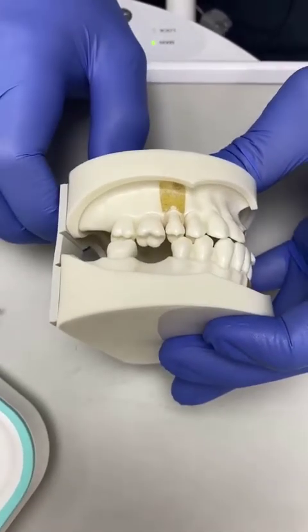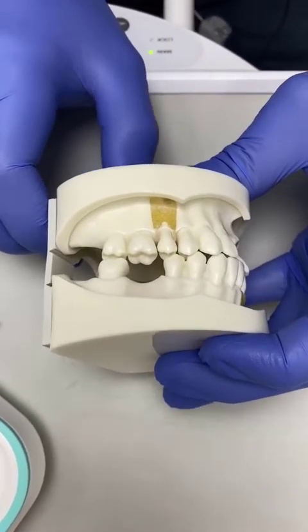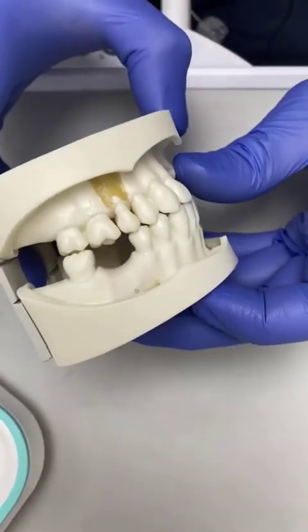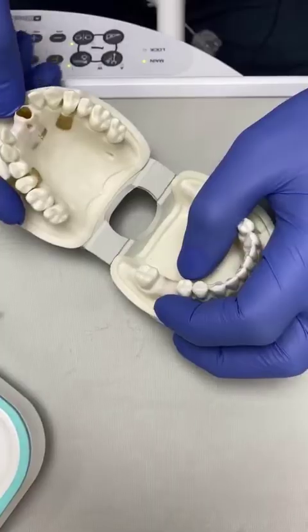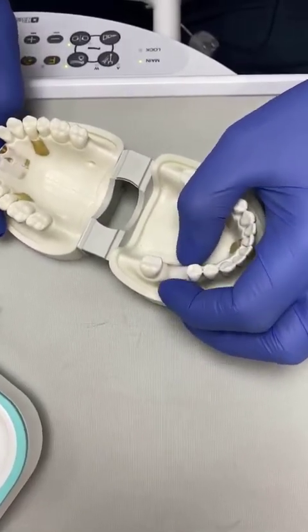Is that absolutely 100% critical? To be honest, it probably isn't, as we've already seen from many studies about angled implants and implant angulation, but in terms of biologic principle this is the best approach.